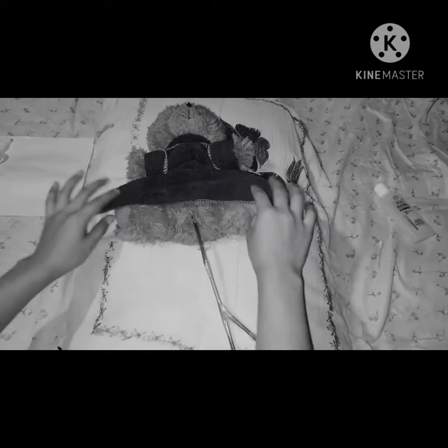Okay, Miss Smith, the procedure is done, and I am going to record. The insertion is already done, and as you can see, I have already cleaned the working place, and now I'm going to document the findings of my patient.